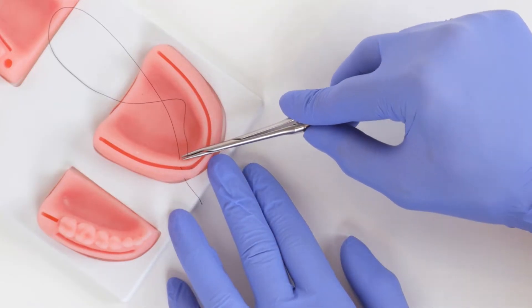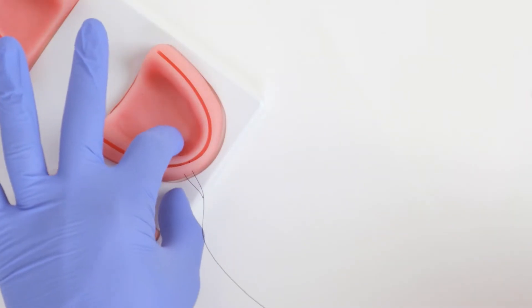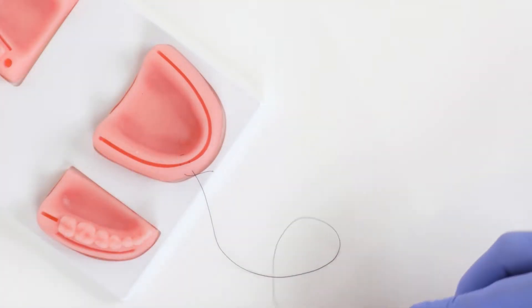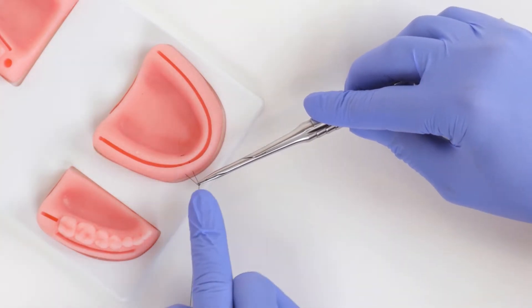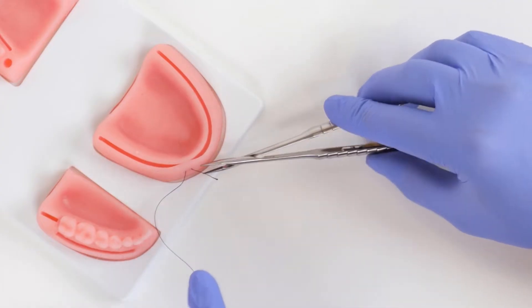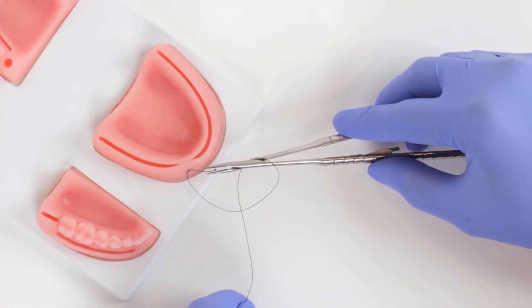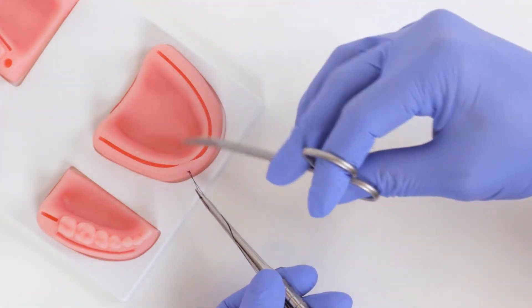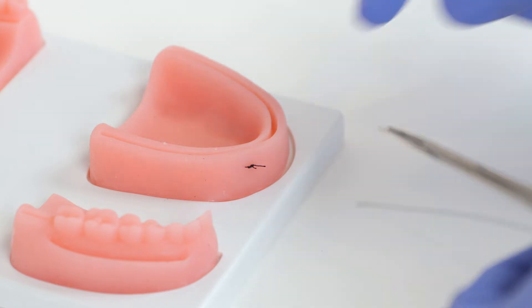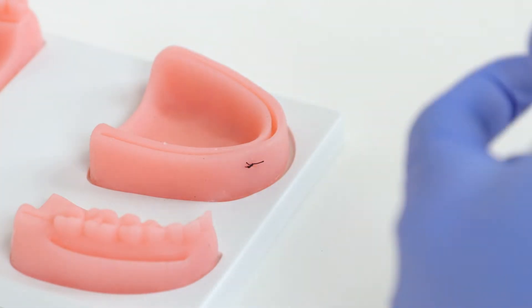Now we come back lingual to buccal. Not only does this help reduce tension, but it also pushes the tissue more coronal. I really like to do this around healing abutments, especially if you have good keratinized tissue — it forms a really nice seal. There we go, we tie it off — there's our horizontal mattress. You want to be careful not to tie these too tight or put too much tension on the knot, because it's horizontal and pushing together, which can choke the blood supply at the base of the flaps.